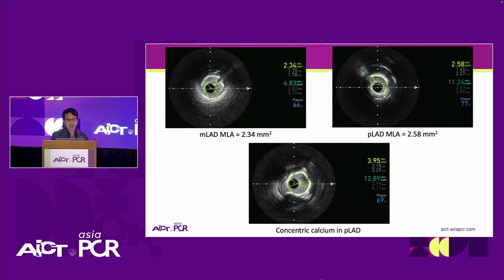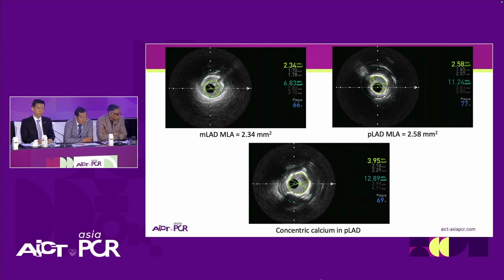So I think imaging is very helpful. The standard practice would be to get the EEL reference distal. So in this case, the diameter averaging about 3.5 millimeters. So we halve that for the optimal burr size of 1.75. You may or may not want to go straight away 1.75, especially if you're just starting on rotor ablation. Maybe start with a smaller burr first and upsize. But about a step down of 50% from the reference EEL distally. That would be the standard practice. Okay, so you go half EEL diameter.